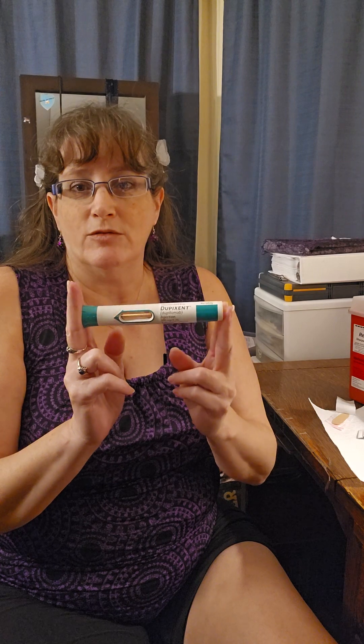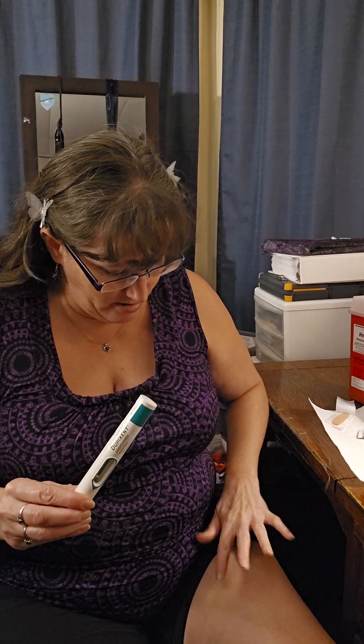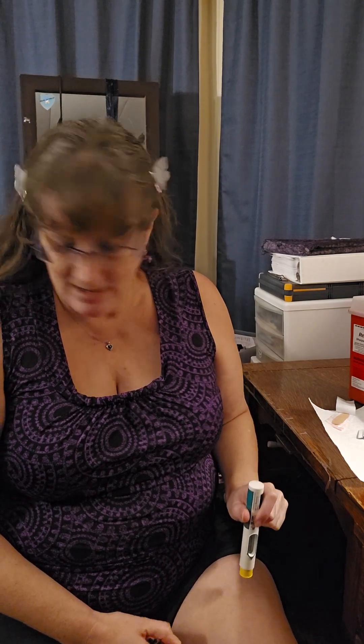Dupixent — I use it for eosinophilic esophagitis, eosinophilic asthma, and chronic allergic rhinitis. Not fun, but this makes a big difference. Let's check and make sure it's nice and dry. Yay, all right, here we go.